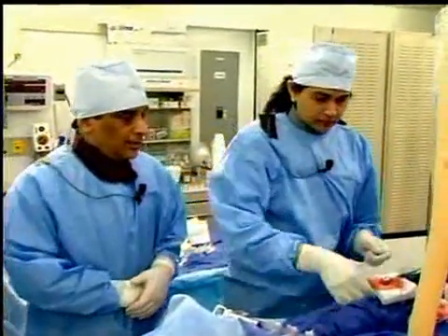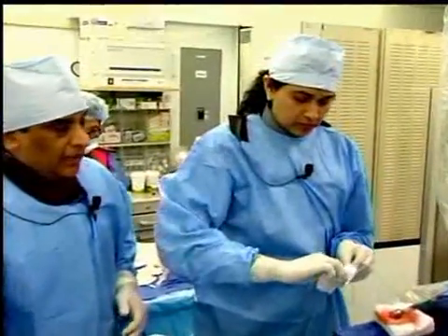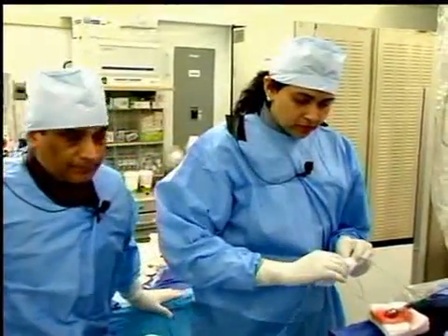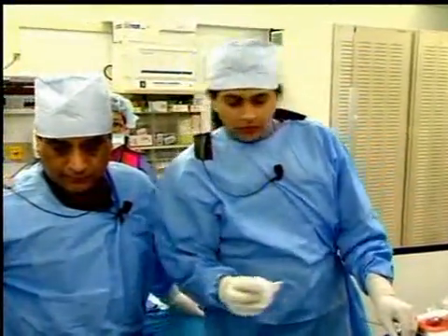And with that note, I think Anu is ready here to start this case with the angulated left main and circumflex. Samin, yeah. Excellent overview, a very practical summary of the follow-up on the SYNTAX. I'm sure the viewers are going to find it extremely beneficial. Unfortunately, our patient appears to be a fallout from the excellent result which one would customarily find in outcomes with high SYNTAX score and CABG, and you have a challenge ahead of you.